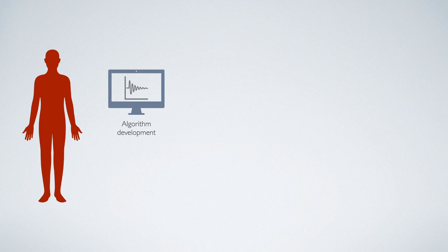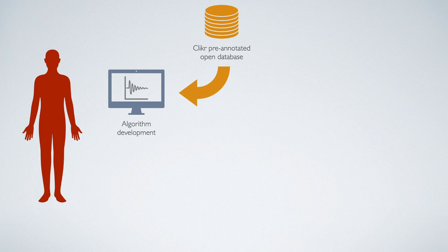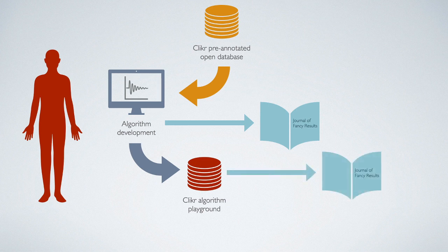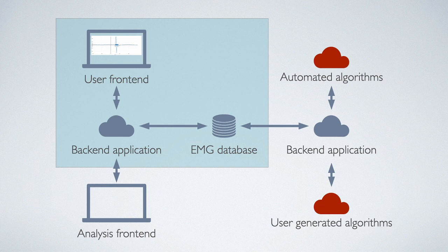We provide a vast dataset of annotated TMS EMG responses from a variety of researchers that can be used for algorithm development. Furthermore, our data are not annotated by a single person, but we provide multiple annotations from different researchers per each response. This vastly reduces the amount of researcher variability influencing the algorithms. Our aim in the future is to have a dataset where each response features a distribution of annotations, which can then be used to estimate the reliability of the data. This researcher greatly benefits from having this large annotated database available. Next, I will talk about how to gather these data.